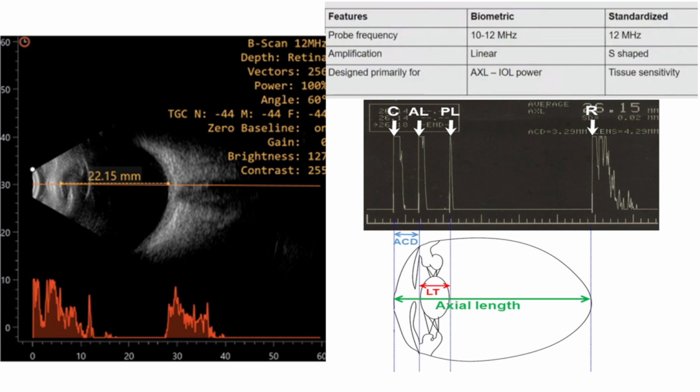In between is the hypoechoic or anechoic vitreous cavity, and the last wave comes from the retina, and the low amplitude waves are from the orbital fat. A scan echoes are seen along with the B scan so we can correlate clinically. This is the standardized A scan, which we use in combination with the B scan.